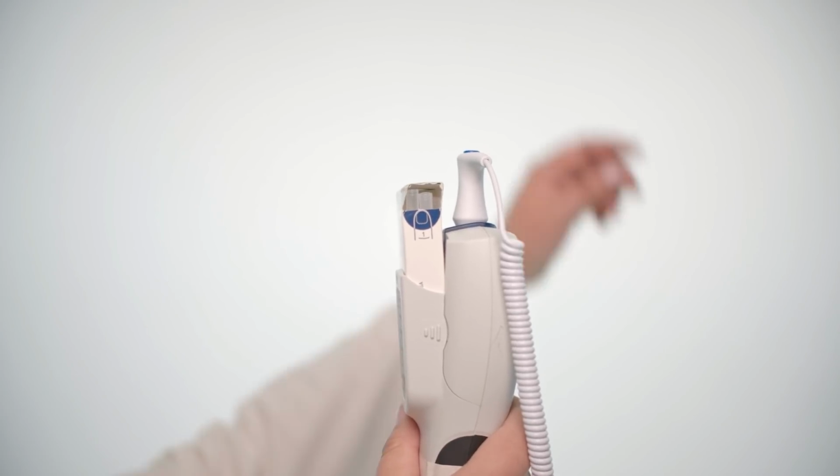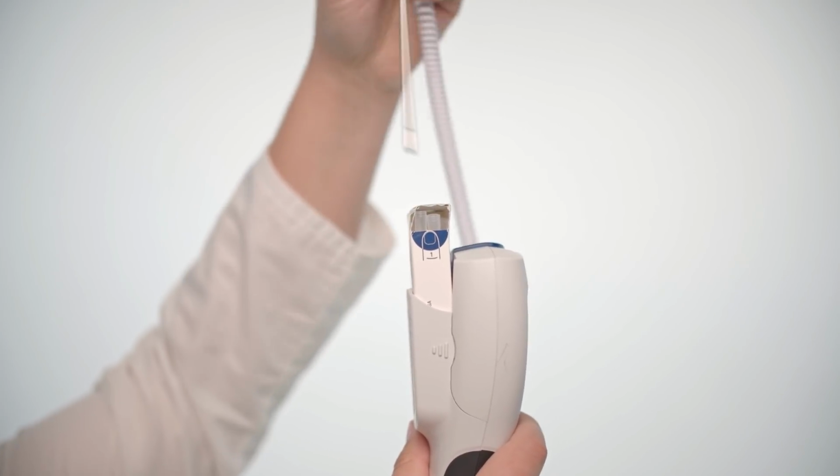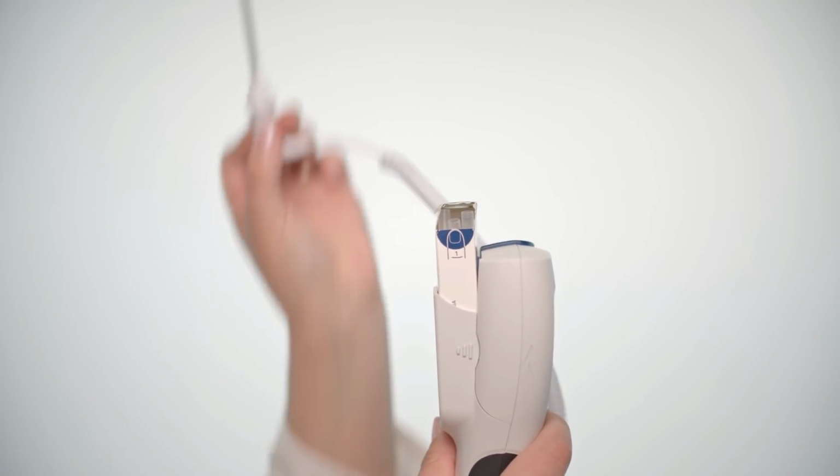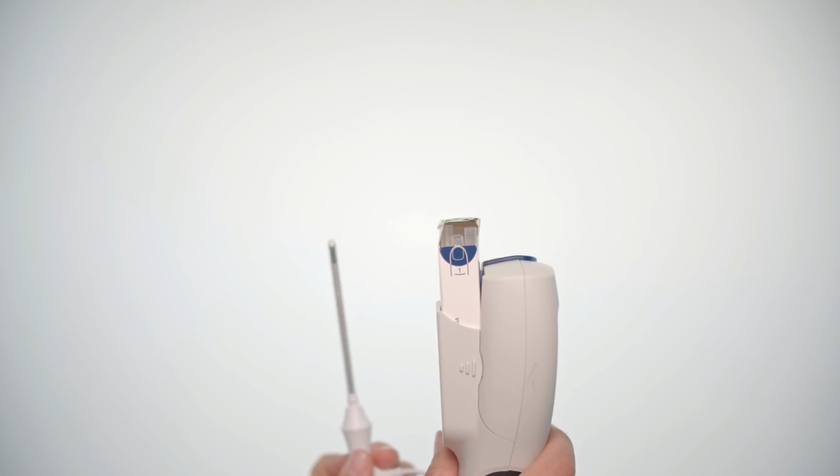Attach the blue oral probe stem to the thermometer. Slide a disposable cover over the temperature probe. Ask Fred to open his mouth and insert the thermometer into one of Fred's posterior sublingual pockets, at the base of his tongue, not in front of it. Ask Fred to keep his lips closed. Wait 20 to 30 seconds, or until the thermometer chimes.